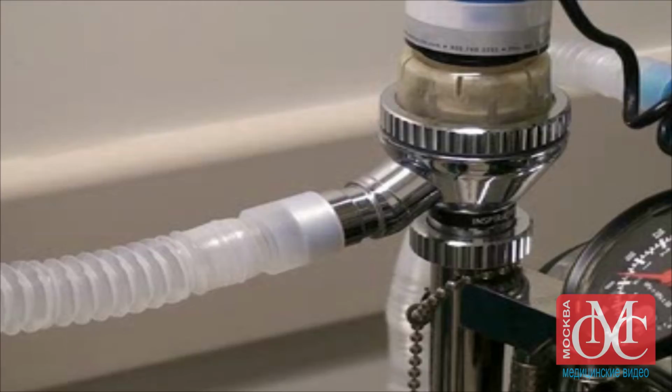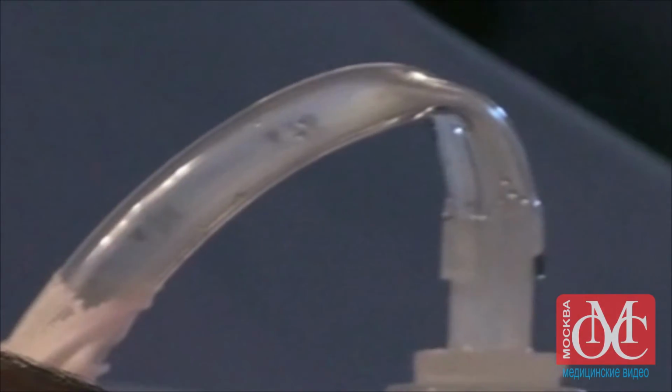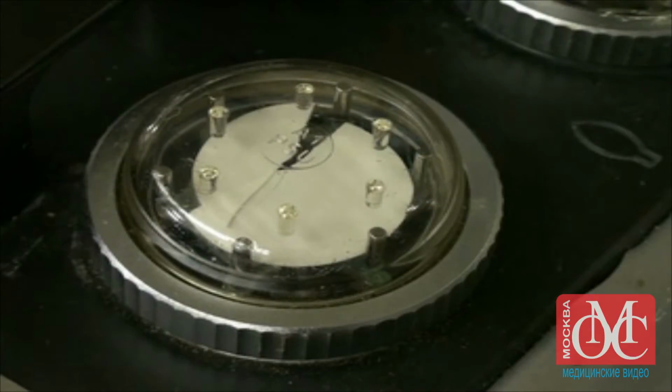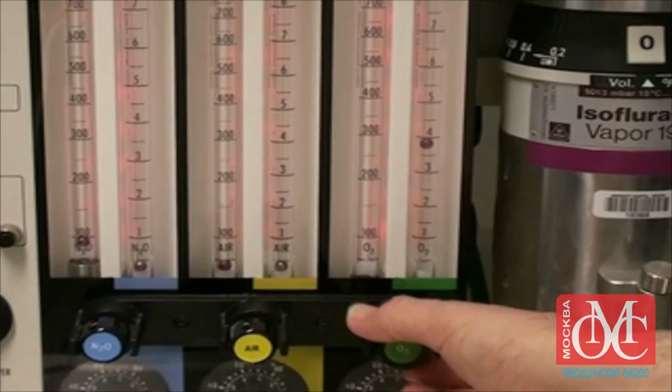Loss of the capnographic waveform may be caused by apnea, disconnection of a ventilator circuit, occlusion or dislodgement of an endotracheal tube, or occlusion or disconnection of the sampling line. Waveforms that do not return to zero during inspiration indicate rebreathing of carbon dioxide. This can occur if the carbon dioxide absorber in an anesthesia machine is chemically exhausted, if a valve in the ventilator circuit is not functioning properly, or if the flow of fresh gas is insufficient. An elevated baseline can also be seen if the device is calibrated incorrectly.